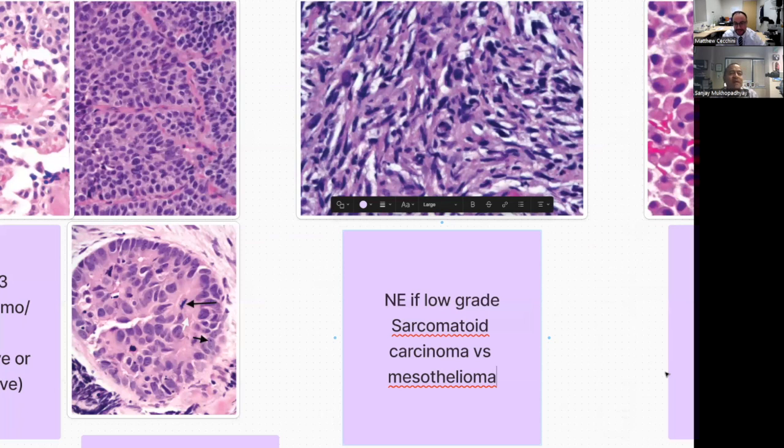And again, Matt, I'll put this scenario to you. Let's say you have this kind of tumor, clearly malignant, pan-keratin diffusely positive. And then I tell you the mass is a solitary 7 centimeter intraparenchymal lung mass. Will you call it meso with diffuse GATA? No, right? So the clinical setting can override even the most compelling immunostain, because it's so important where it is and what the imaging features are.